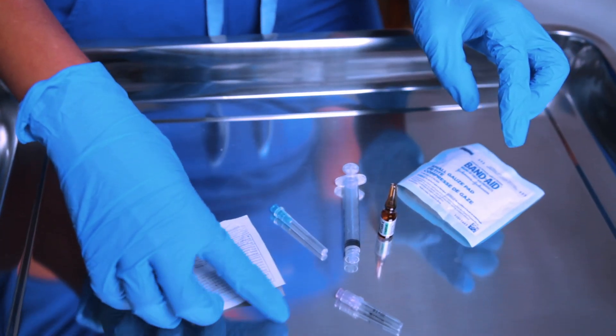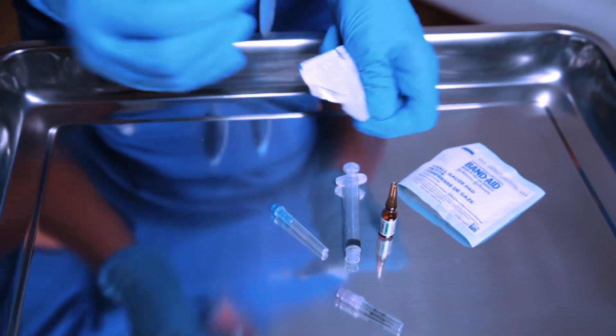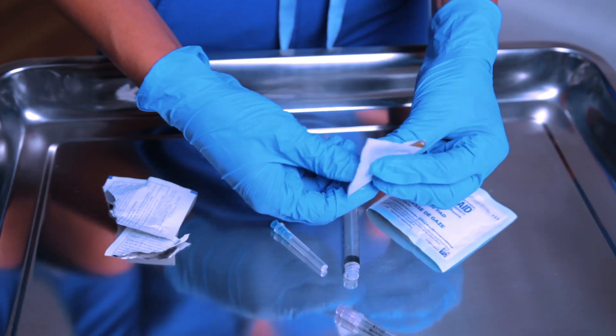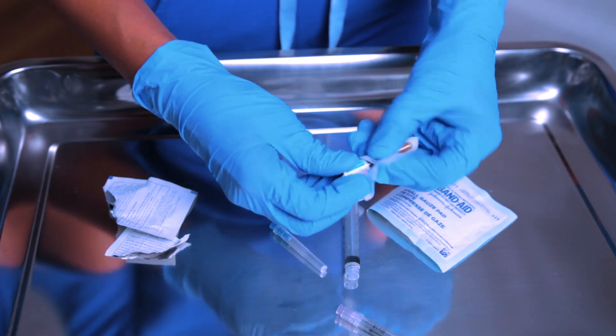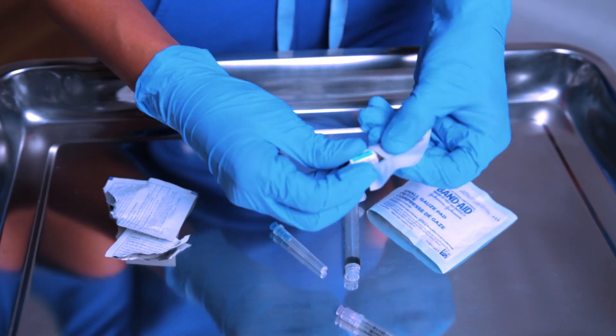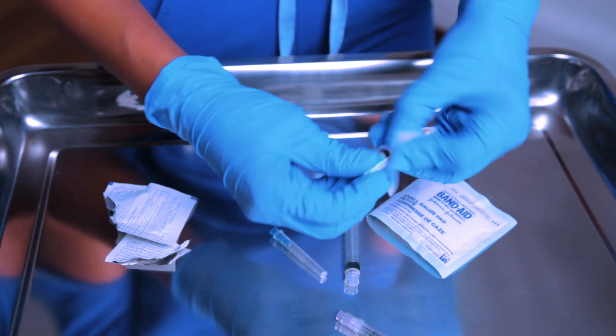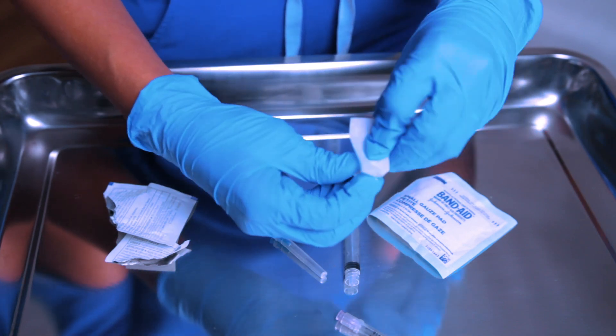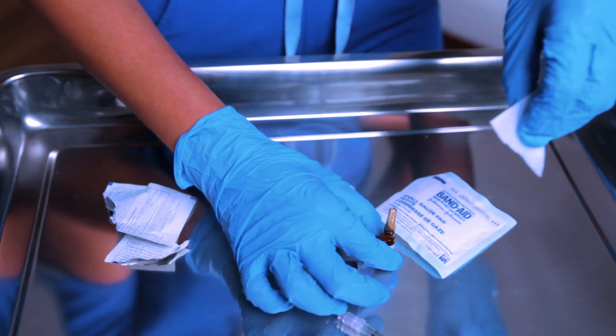You're going to gather your supplies. You're going to open up your alcohol prep. Once you have your alcohol prep open, you are going to clean the neck of the ampule because you want to make sure that that is not contaminated and that it is clean. So once that is nice and rubbed down over a few seconds, then you can put that to the side and let that air dry.